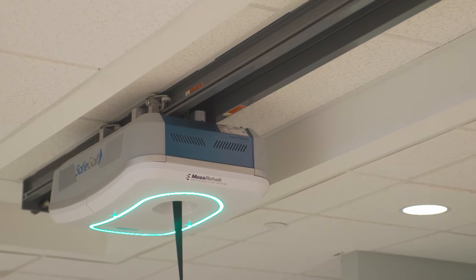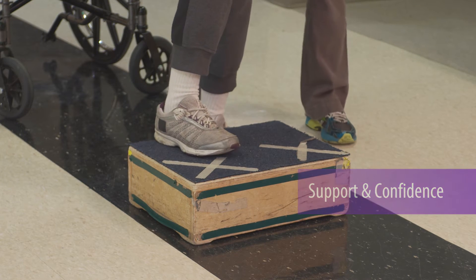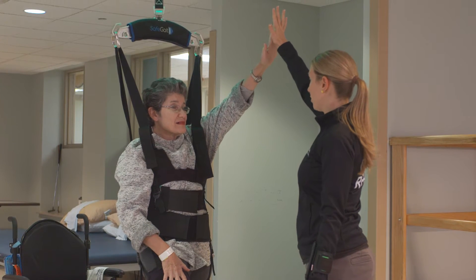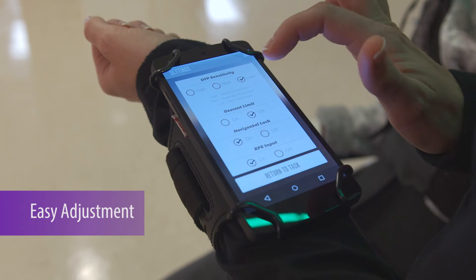The SafeGait gives patients the support they need while building their confidence. The versatile SafeGait system allows Moss Rehab therapists to adjust treatment programs to adapt and challenge patients' needs.